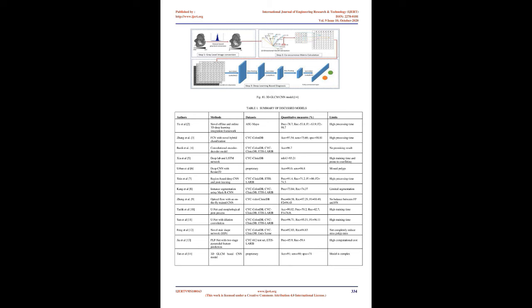The SSN can well balance the inference time and segmentation accuracy. The lightweight backbone with 4 specific residual blocks and simplified upsampling operation allows fast inference time. For the backbone network, an FCN is designed to extract diverse features on different levels.